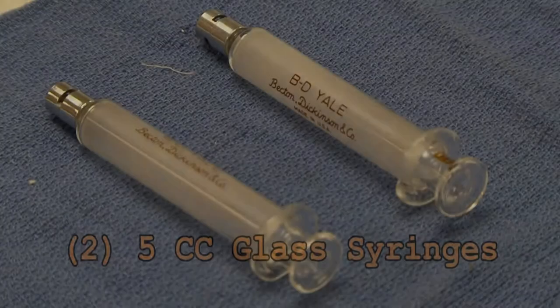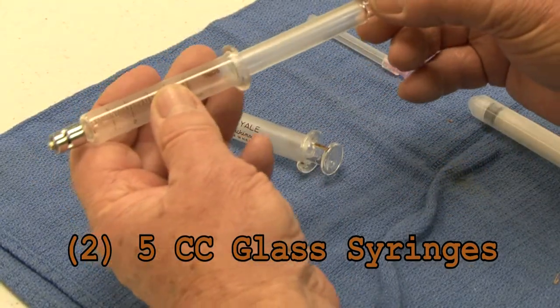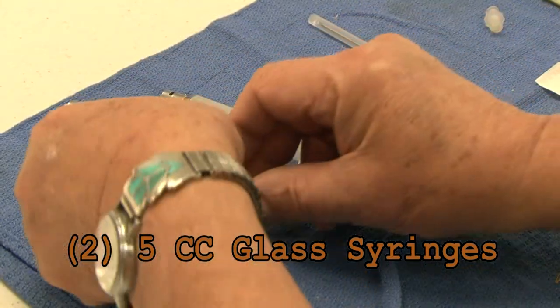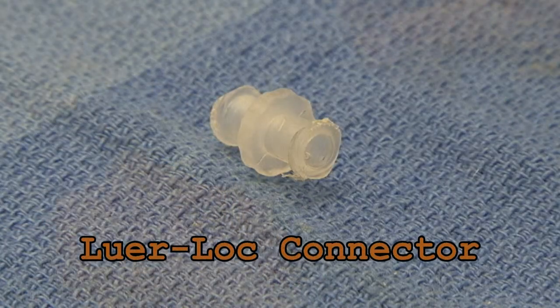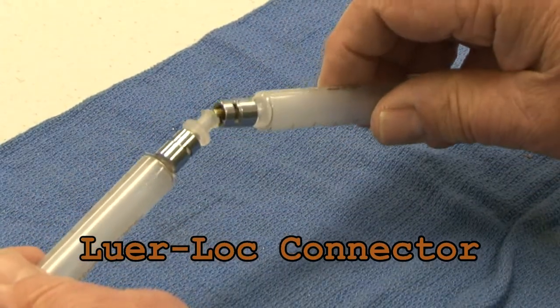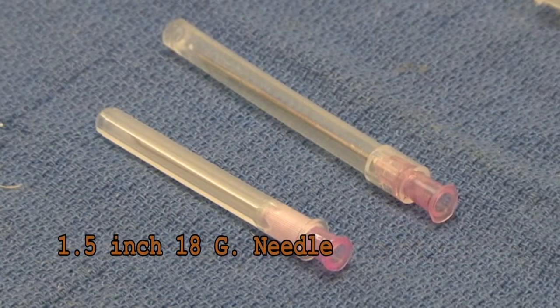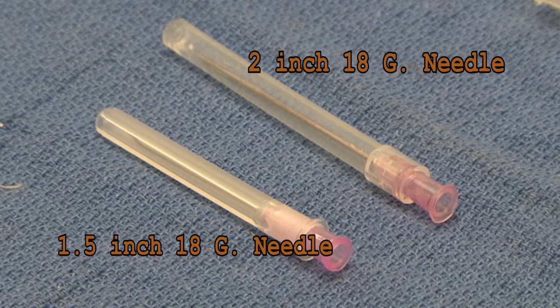The necessary equipment includes a pair of 5cc glass syringes. The specifications for these syringes, which we supply, are found in the vaccine insert. There is also a plastic lure lock connector, with which the two syringes can be connected. Finally, you will need a 1.5 inch 18 gauge needle, and if you are loading darts after mixing, a 2 inch 18 gauge needle.